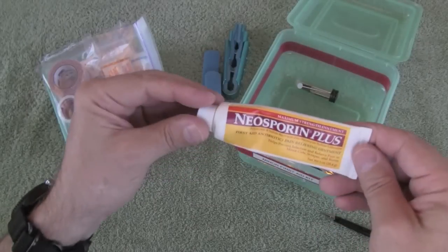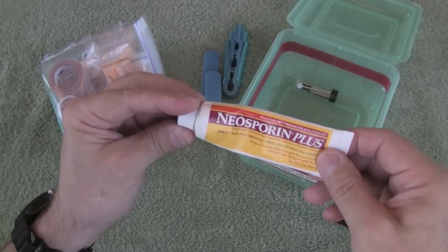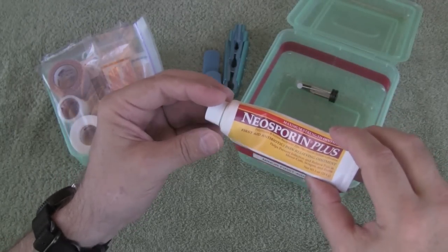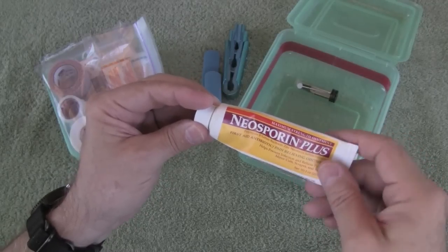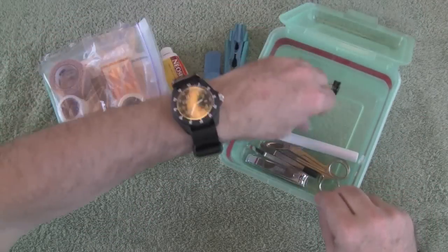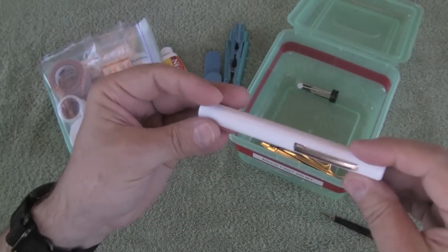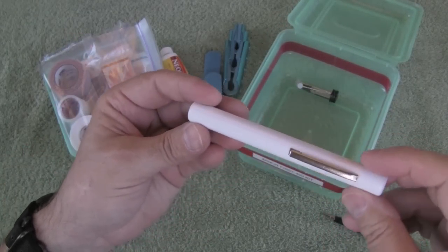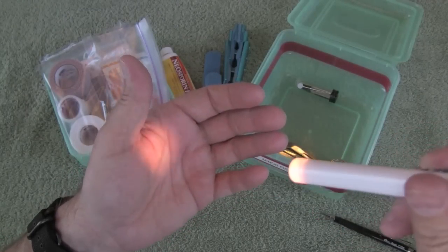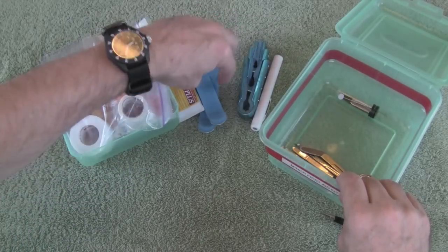There's a tube of antibiotic ointment in there. In this type of kit a tube is better than individual packets, but you can certainly pick whatever works best for you — this is kind of a multi-use way to go, the way I look at it. There's also a small pen light. I just had this sitting in a desk drawer and threw it in there, and once in a while it's good to look in an eye if there's a foreign body, so that's what that's there for.